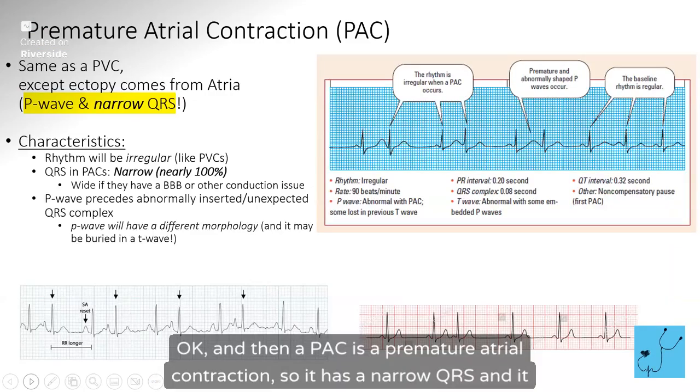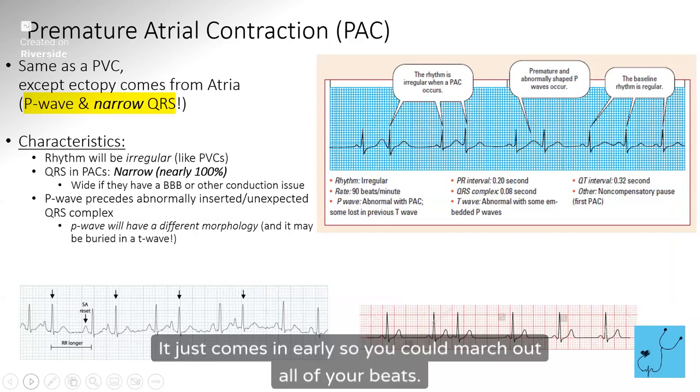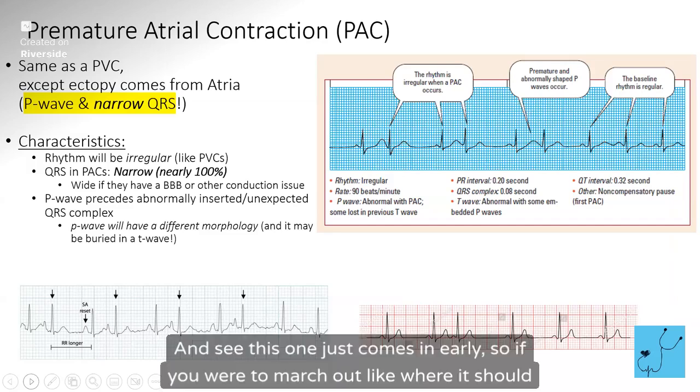Okay, and then a PAC is a premature atrial contraction, so it has a narrow QRS. And it almost always is the same shape as all the other complexes. It just comes in early. So you could march out all of your beats and see this one just comes in early.